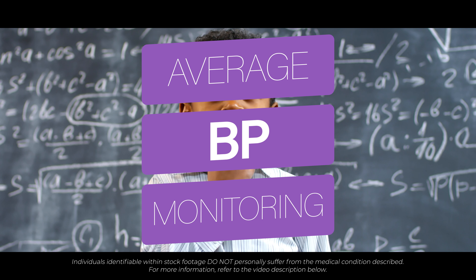Blood pressure will vary from day to day. Therefore, your doctor may request for you to complete an average home blood pressure check. To do this, take readings morning and night for seven days. Record these numbers and submit them to your doctor for their assessment. An average home blood pressure assessment gives your doctor a better idea of what your blood pressure is normally like.